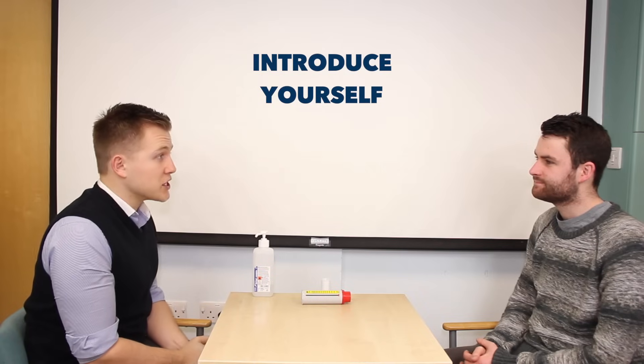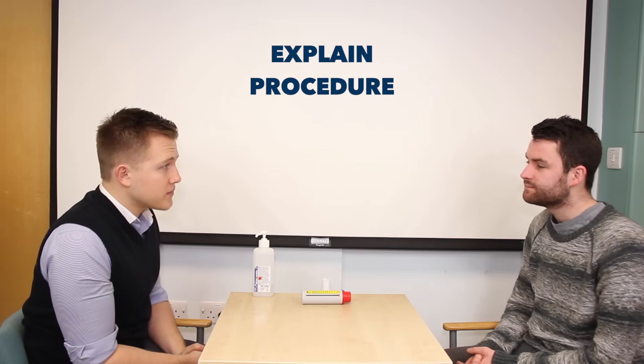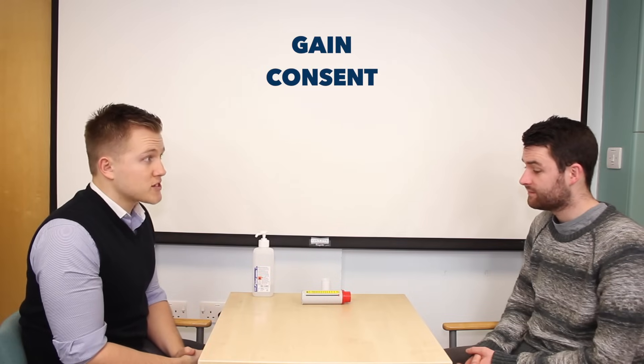Good morning, my name is Andrew, I'm one of the final year medical students. Could I just confirm your name and age please? I'm Simon and I'm 24. Nice to meet you Simon. Today I've been asked to take something called a peak flow measurement. This will just involve breathing out into this peak flow meter on the table. It'll just help us assess how well your asthma is controlled at the moment.